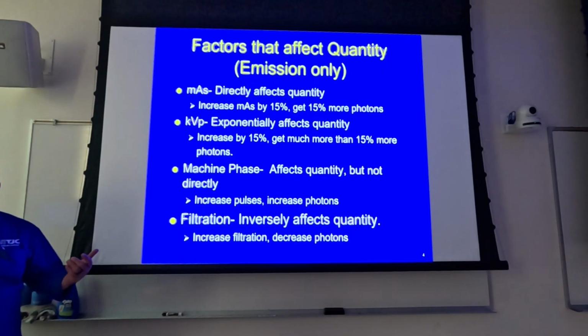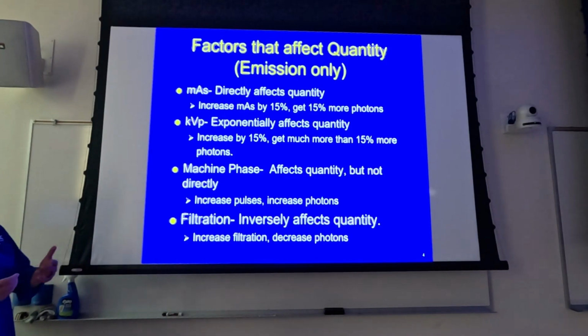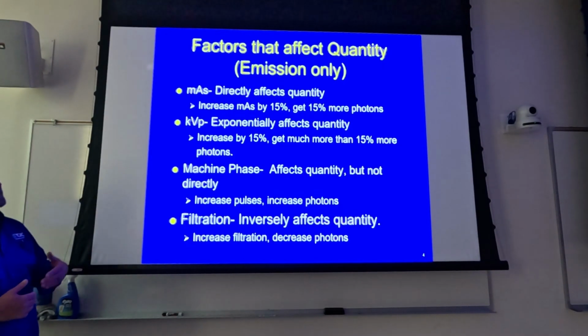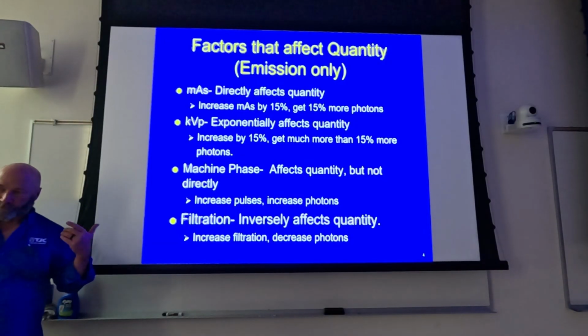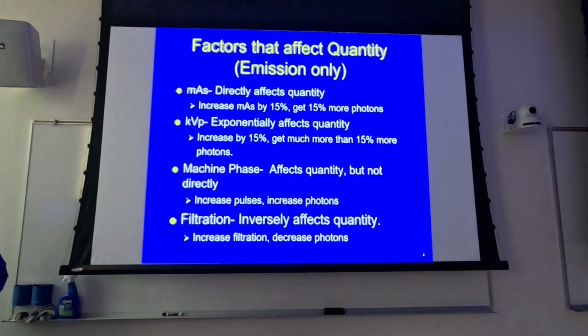In my drawings here in a bit, it's not going to bear that out, but you know, I can't really draw it to be perfect, but you'll get the idea. With kVp, though, it's exponential. Now how you remember this is direct and it's exponential. And how you remember this is with your 15% rule.